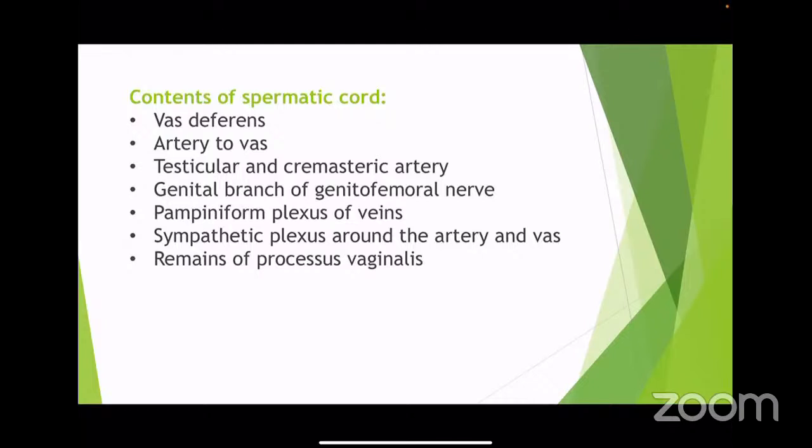It may be one-sided. If you make that mistake on both sides, the patient will have infertility, and if on one side, then fertility will be decreased somewhat. I can't say it will be decreased completely because he has the other side, but that is not good for the surgeon to do without any indication. Ligating the vas deferens is not a right practice, right?